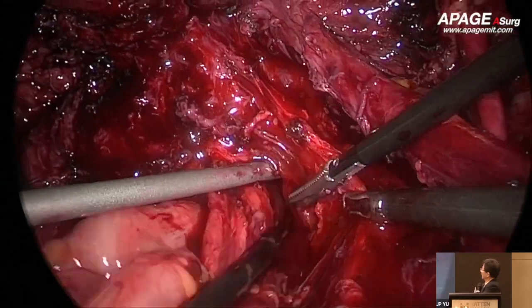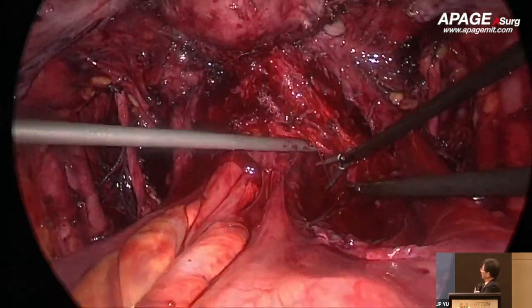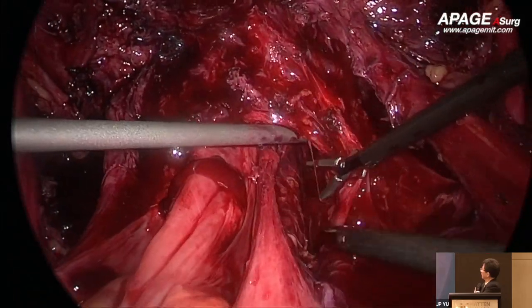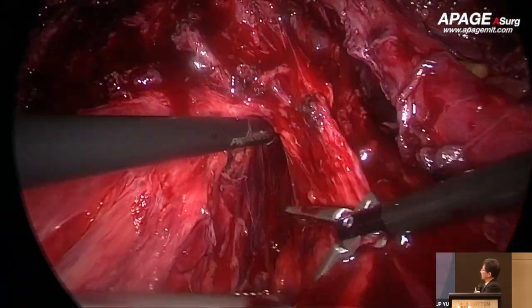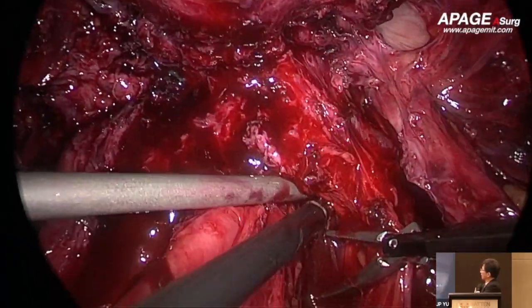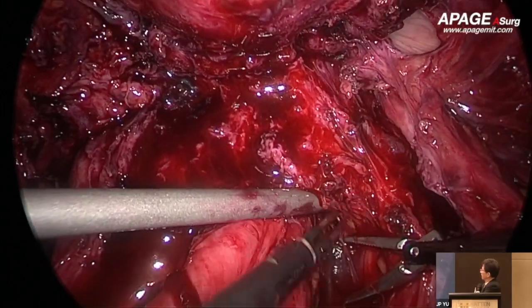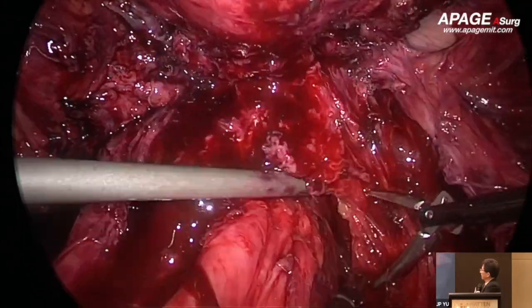Okay, so the medial pararectal space comes out here, and the colon will be identified here. When we trace the rectum, we can identify the position of the colon. So it will be much easier to identify the medial pararectal space here.